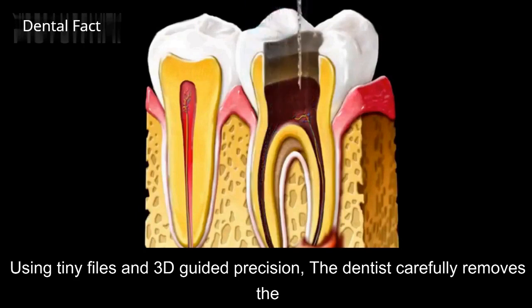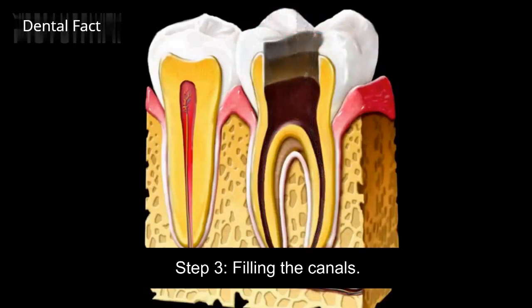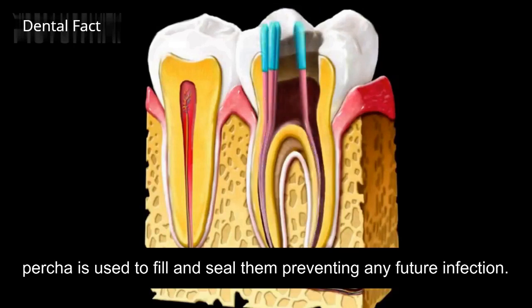Using tiny files and 3D guided precision, the dentist carefully removes the infected pulp, thoroughly cleaning and shaping the root canals. Step 3. Filling the canals. Once the canals are clean and shaped, a biocompatible material, usually gutta percha, is used to fill and seal them, preventing any future infection. Step 4.